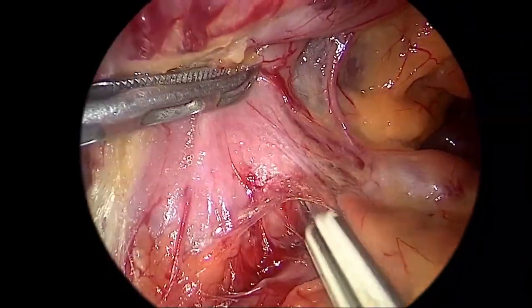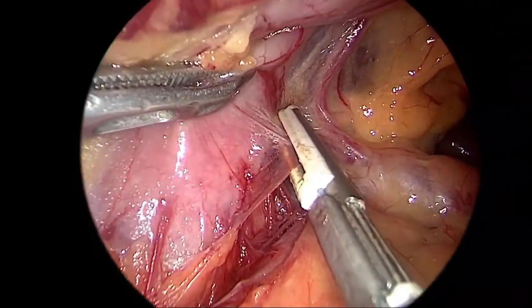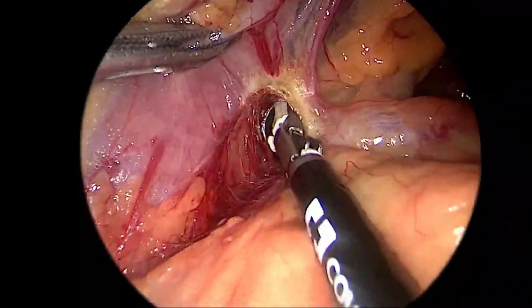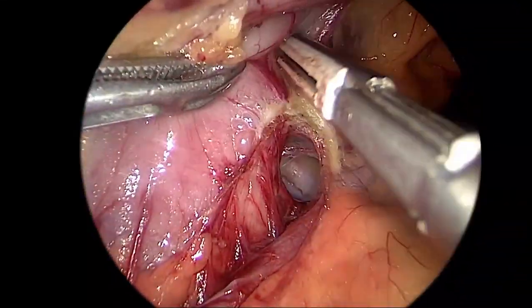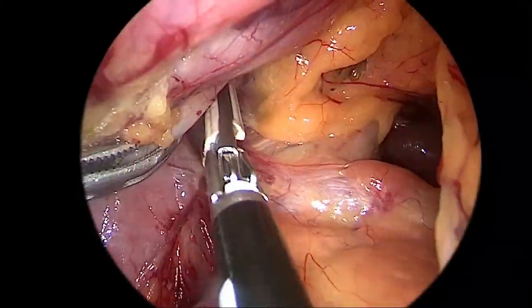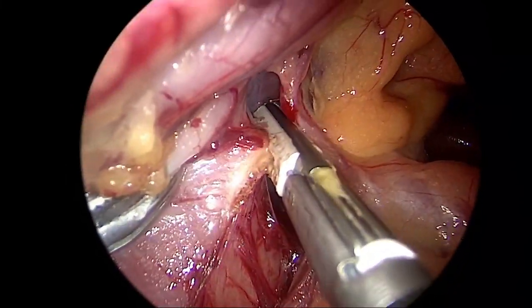Coagulating these small branches helps me get a good window. In this window I will encircle the first part of the duodenum. Now I can dissect the branch between the supraduodenal artery and the duodenum. This is a small branch. When I dissect it and coagulate it, I will have a good window for the passage of the stapler. At this time, I can clearly see the common hepatic artery, the supraduodenal artery, and the gastroduodenal artery.